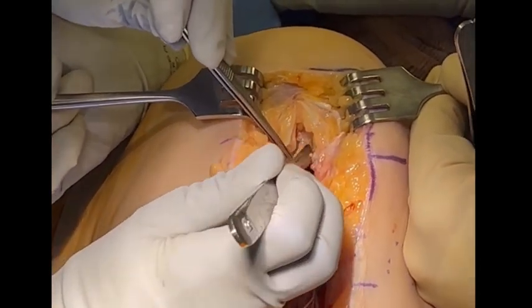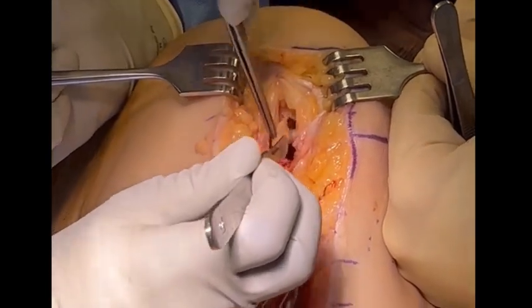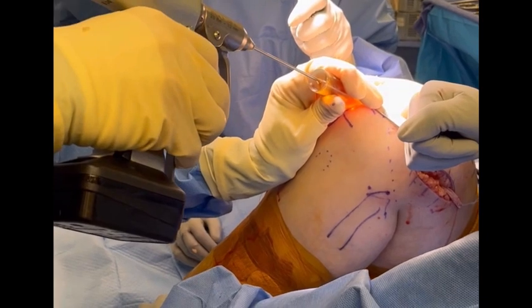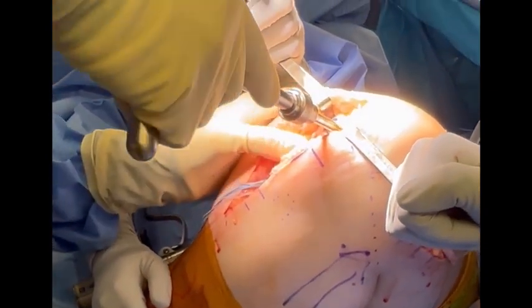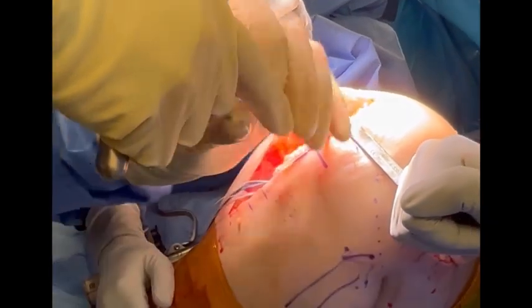A 3-inch arthrotomy incision is made over the medial femoral condyle, encompassing the previously made portals. The knee is now flexed to 120 degrees to visualize the cartilaginous lesion. A central guide pin is placed and a 20 mm sizer is chosen as appropriate in this case, as it adequately covers the lesion, covering it completely posteriorly, laterally, and medially, with only a small amount of grade 2 change remaining in the anterior non-weight bearing zone.